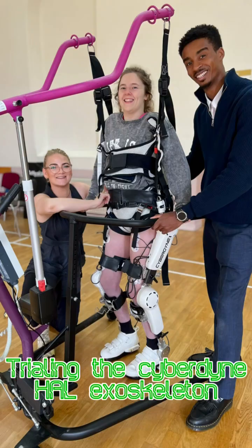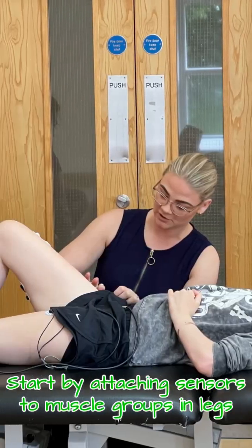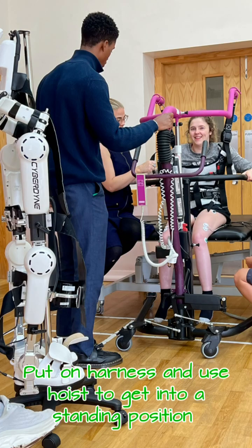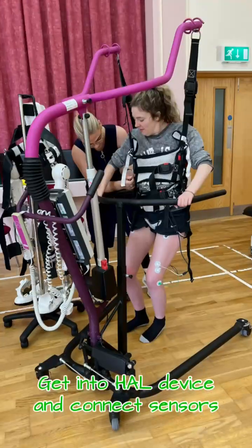Trialing the Cyberdyne HAL Exoskeleton. Start by attaching sensors to muscle groups in the legs. Put on a harness and use a hoist to get into a standing position. Then get into the HAL device and connect the sensors.